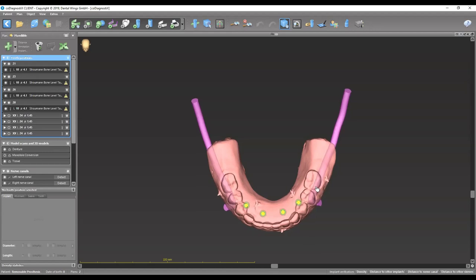The second criterion is we want to make sure the implants are planned as parallel to each other as possible. That serves two purposes: it will be easier for the denture pickup, and easier for the patient to remove and place the denture back in. If you have more angulation difference between implants, that can still be compensated with locator attachments that can restore up to four degrees of angulation difference, but the ideal solution is planning the implants as parallel as possible.